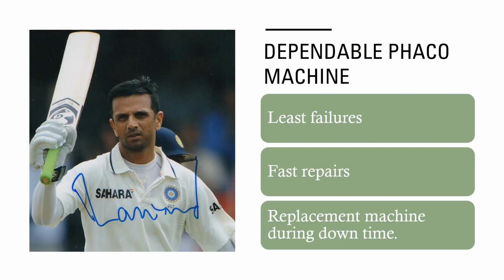And then there is something like dependability. They should have least failures and should have fast repairs, and the company should be able to provide you with a backup machine during the downtime, so that it doesn't affect your business.